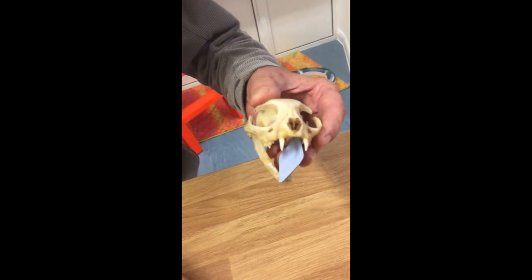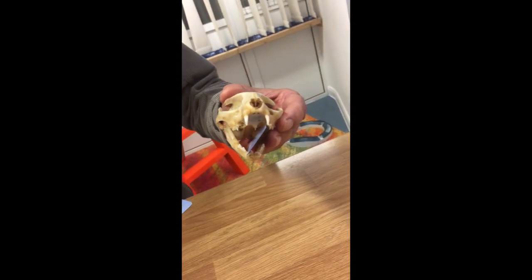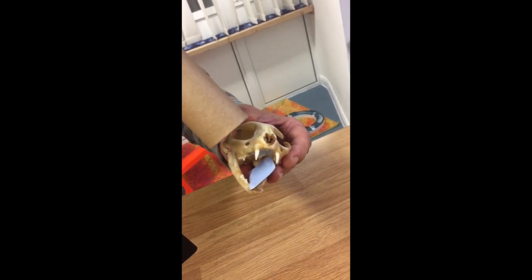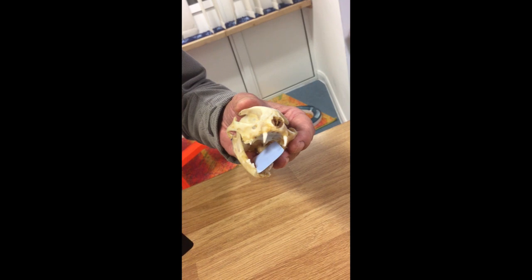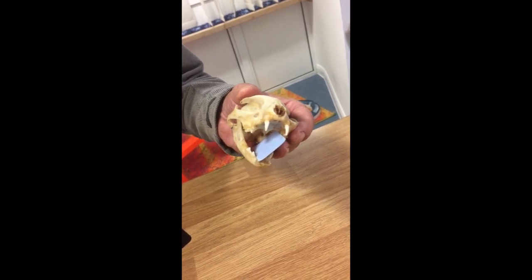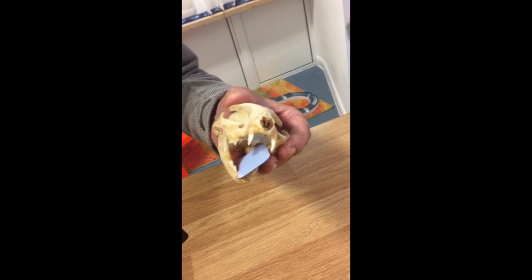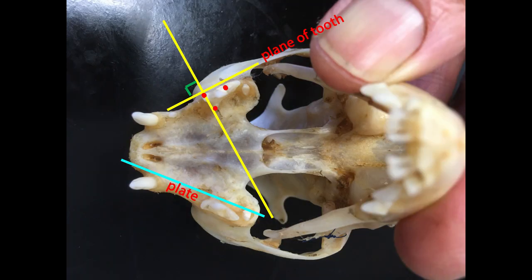If you look down there now, we now need to come down and put our beam so it's parallel to the x-ray plate, and then far away, and that's your view, and miraculously this orbital rim is out of the equation. So just looking at the angles there, normally we would place the beam perpendicular to the plane of the tooth, but if you see where that takes us now, it's going to project the roots of that carnassial beyond the edge of the plate.